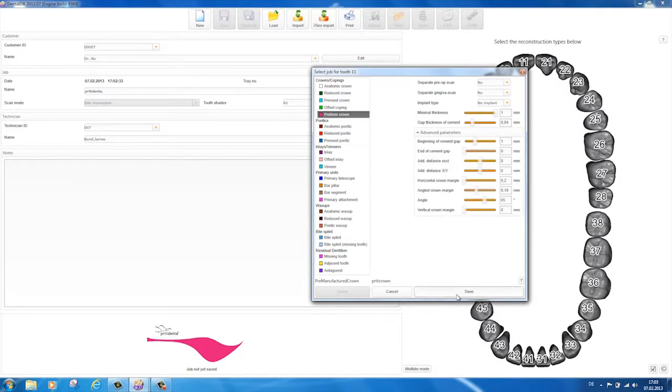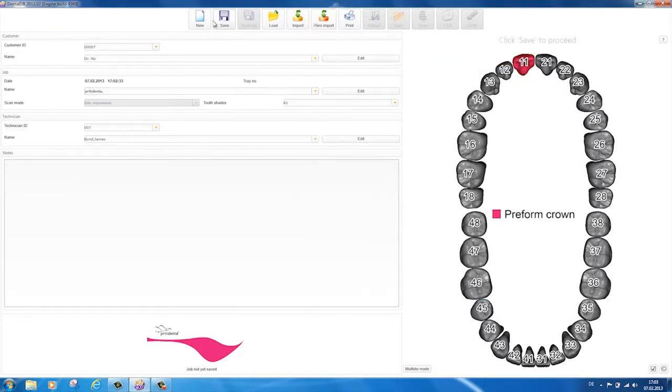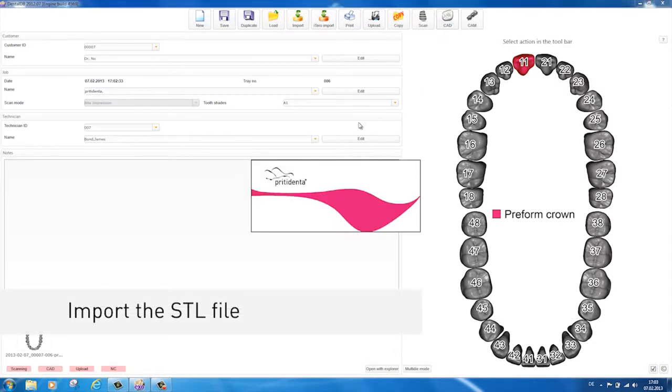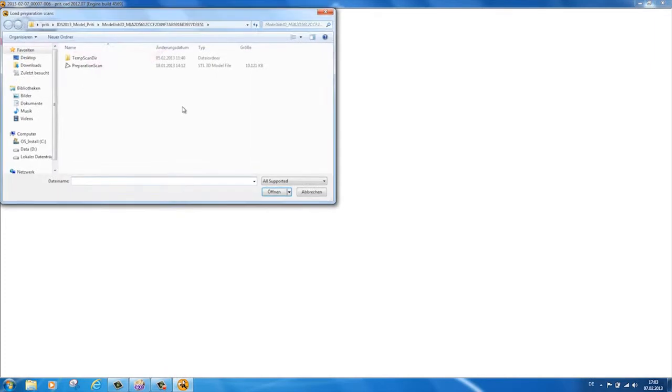Then you import the patient's STL file to the interface. This file can be created by using an intraoral or model scanner.